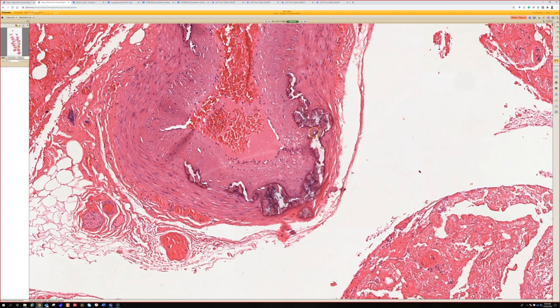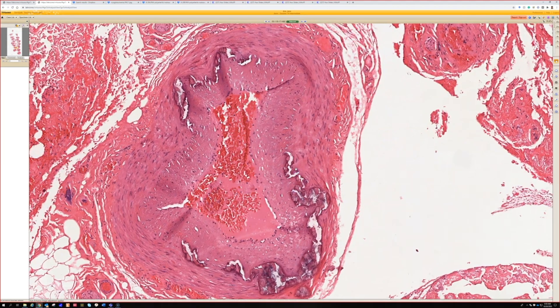There are kind of two different things you could think of in this setting. One, you could wonder if this calcification is associated with atherosclerosis. In atherosclerosis, where the cholesterol and atheroma plaque builds up is in the intima of the vessel. Here the intima is thickened - to me this is thicker than a normal vessel, probably an older person with hypertension - but I don't see any deposits of lipid-filled histiocytes or cholesterol crystals, those long clefts. I don't see those to make me think of a plaque.